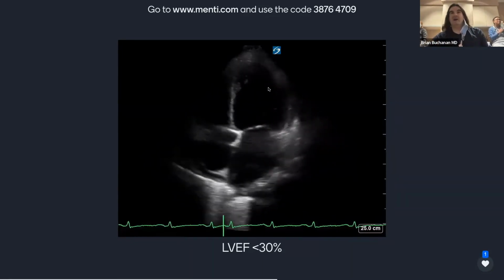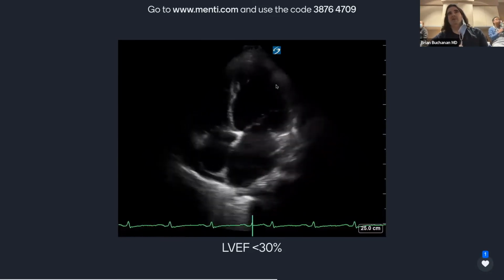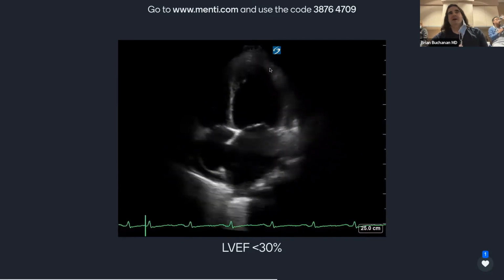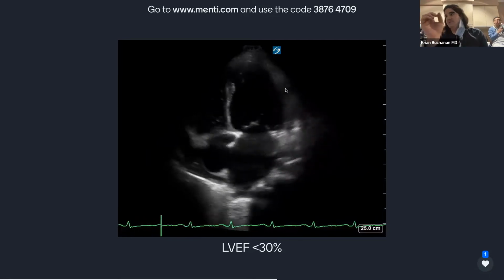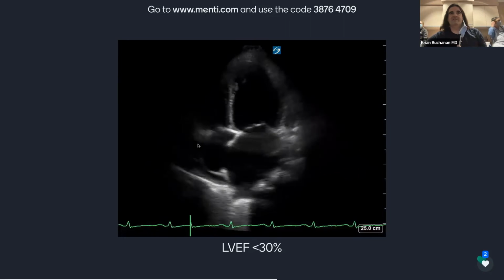And then you won't say that this is the anterolateral wall. We actually have kind of lost this area, so we don't really see endocardium there at all. That certainly is a limitation to be aware of. As I mentioned before, seeing the endocardium is really critical to testing LV function. But this is obviously very depressed.